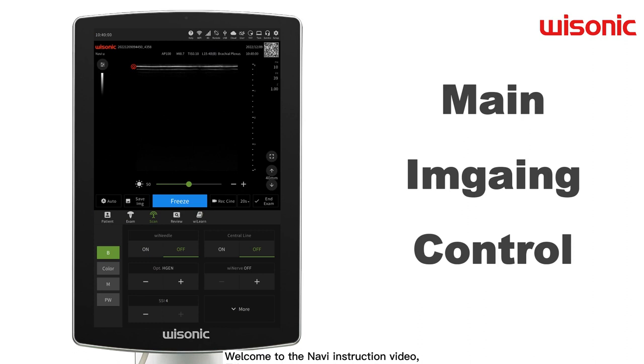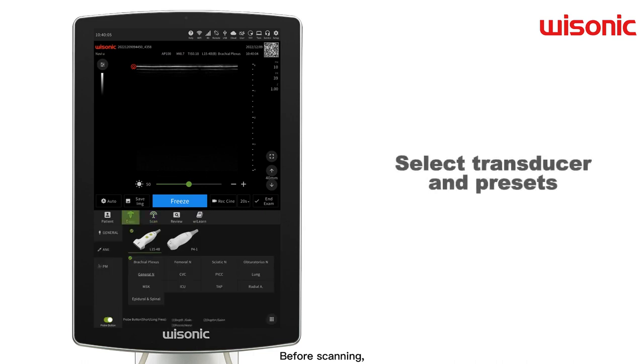Welcome to the NAVI instruction video, Main Imaging Control. Before scanning, select the transducer and preset according to the examination first.